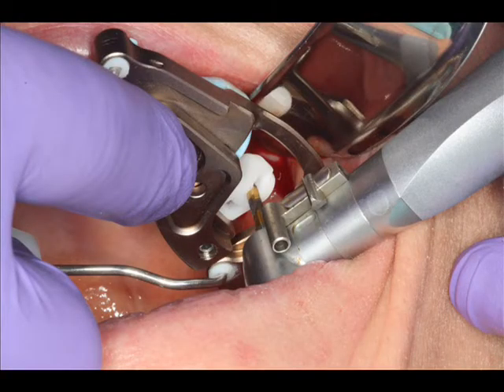The process is intuitive once you've seen it. You can expect to be ready for guided surgery in less than 10 minutes with the most precision you have ever experienced.